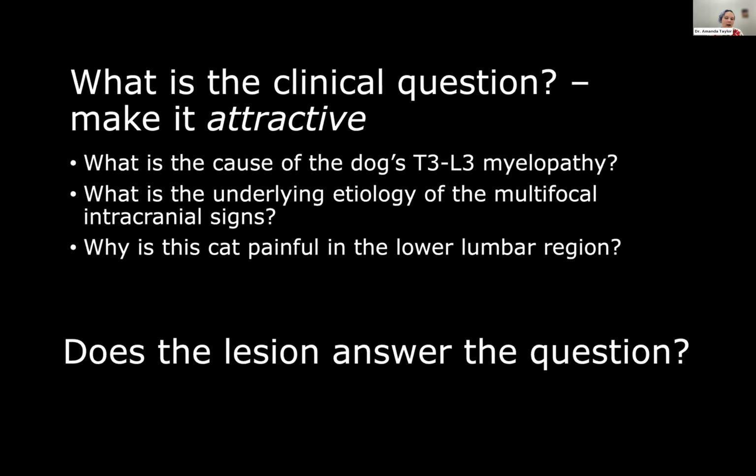It's important to make it attractive to keep a habit. And to me, knowing what the clinical question is for the case you're looking at is how we make that particular part of the examination attractive. What is the cause of the dog's T3-L3 myelopathy, for example? What's the underlying etiology of the multifocal intracranial signs? Or why is this cat painful in the lower lumbar region? And then when you are looking at your images, does the lesion you are seeing answer the clinical question that you came into that case with?